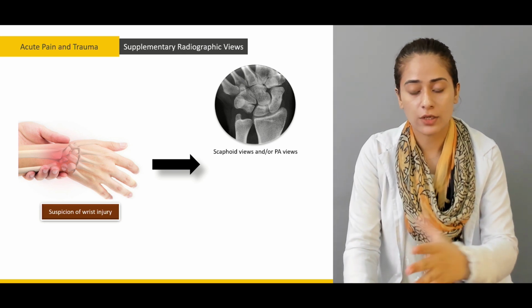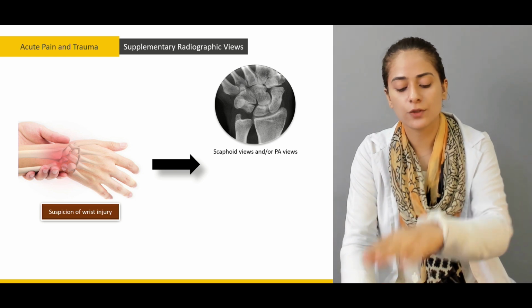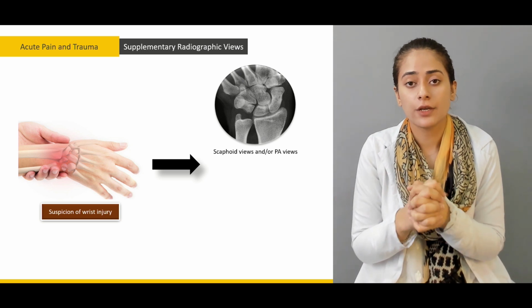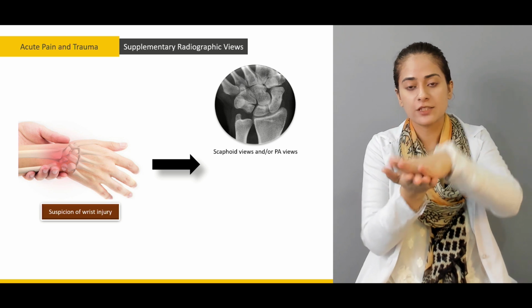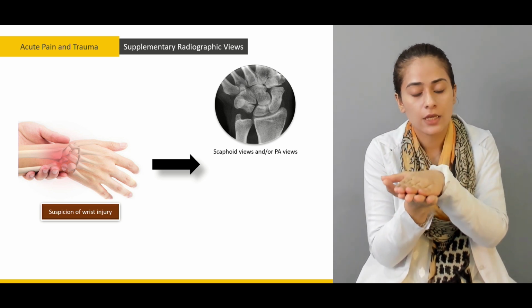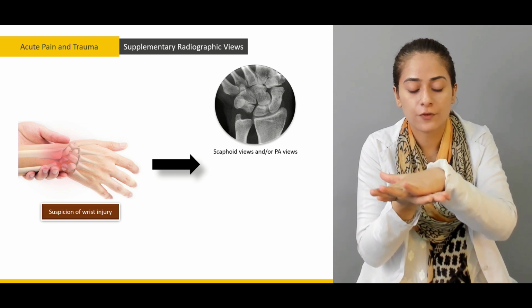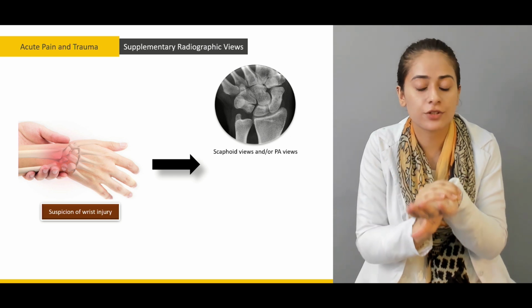So it's also a subcategory of the PA or posterior anterior view, like we talked about in previous videos as well. So PA view is actually posterior anterior, in which your placement is such that the cassette is beneath your anterior surface, and the x-rays are going into your body from the posterior surface.